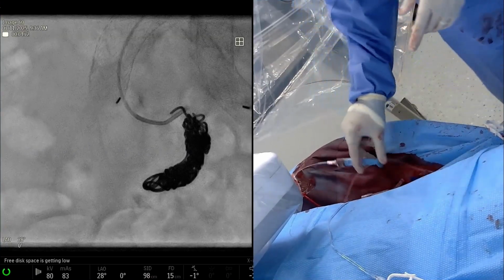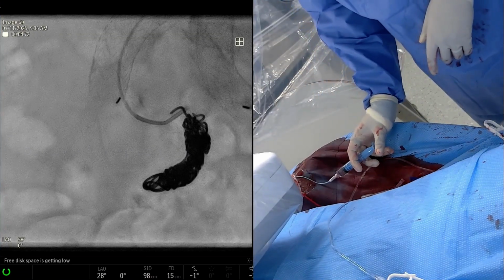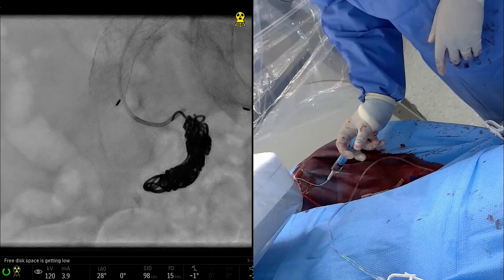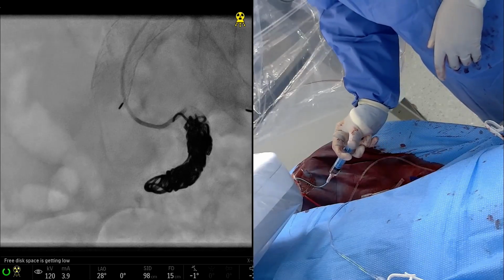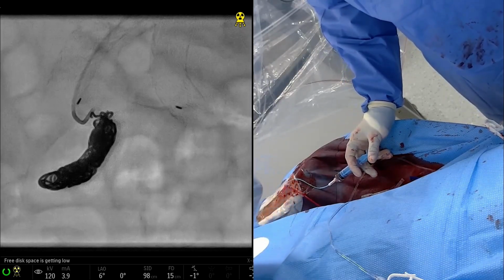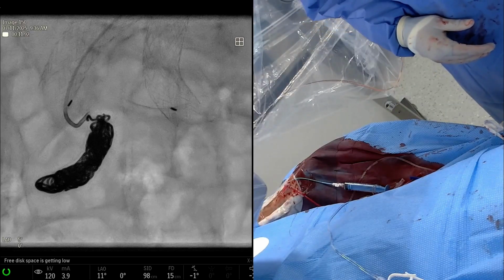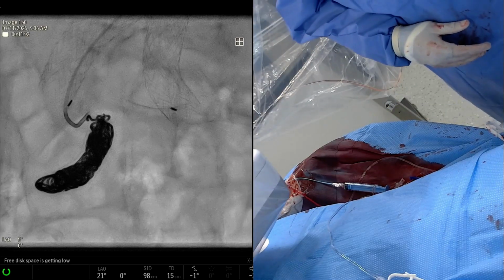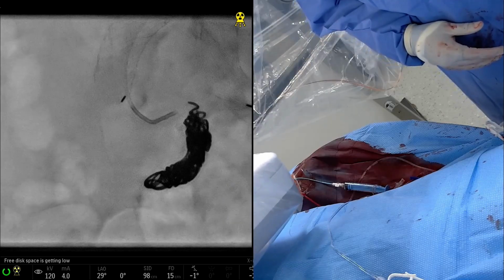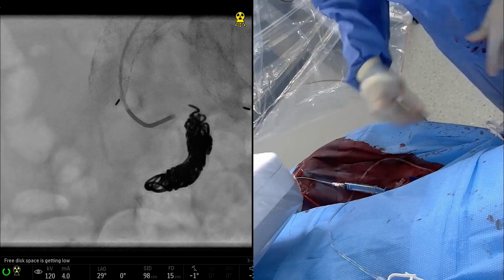So you do have to be careful, especially with the packing coils, because they're really soft. So as you drag your diagnostic catheter back, you don't drag your coil pack back. Right. And one thing sometimes I'll do is I'll hook a Benson wire in and then pull back the base catheter so that it can't happen. You're right. I pull coils in just aneurysm sometimes, but it's so tight. So I'll put the 014 wire in and then gently pull the microcatheter and pull the wire back.